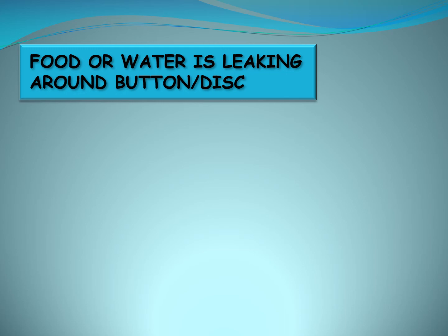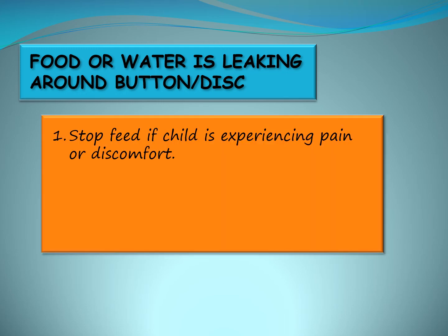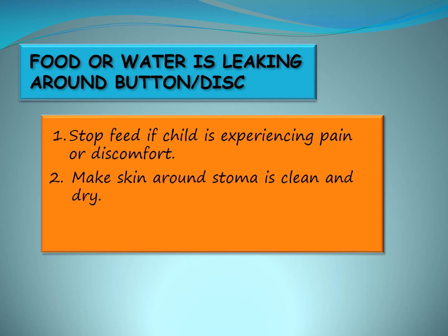If food or water is leaking around the button or disc, stop the feed if the child is experiencing pain or discomfort. Make sure the stoma is clean and dry. Call the parent.